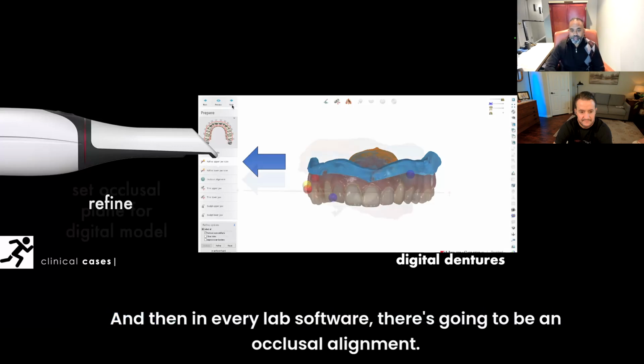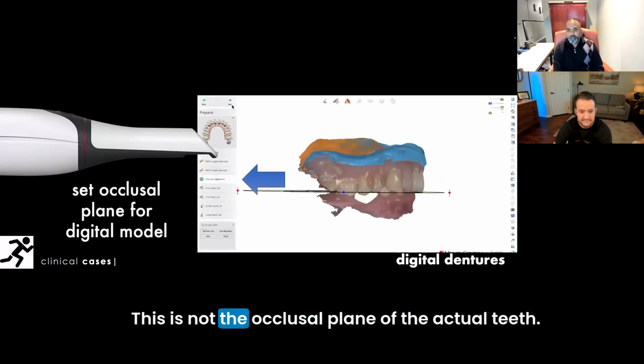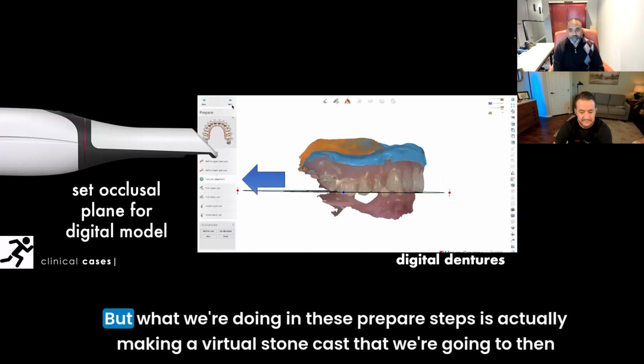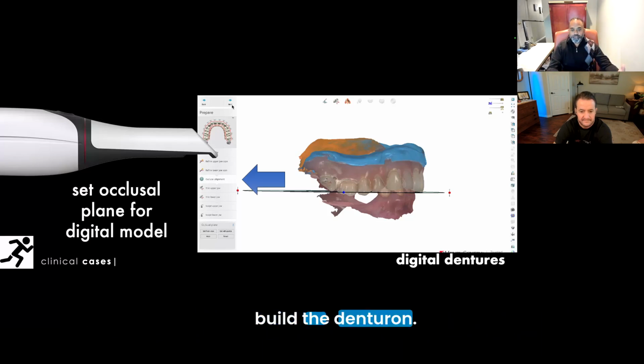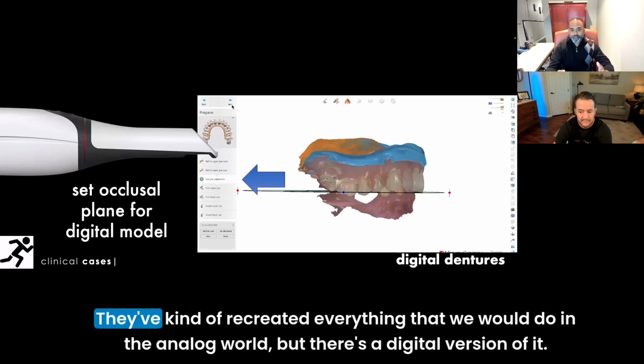Then, in every lab software, there's going to be an occlusal alignment. This is not the occlusal plane of the actual teeth, but what we're doing in these prepare steps is actually making a virtual stone cast that we're going to then build the denture on. The digital laboratory steps are analogous to every analog step. They've recreated everything that we would do in the analog world, but there's a digital version of it.